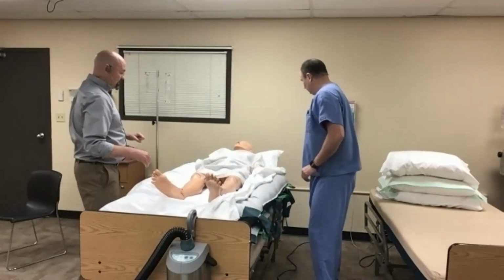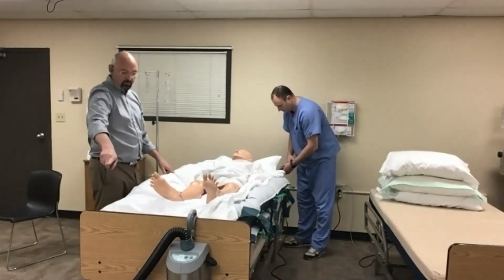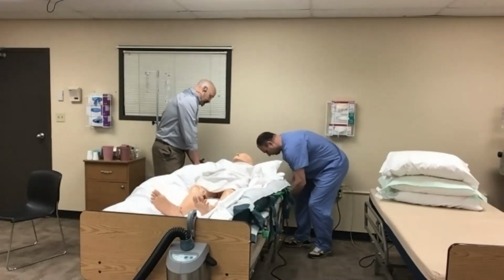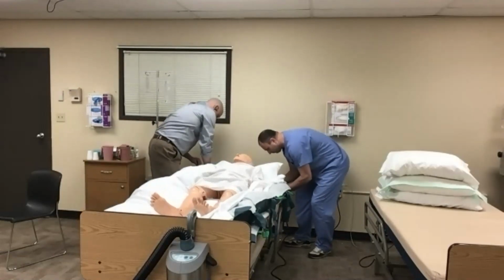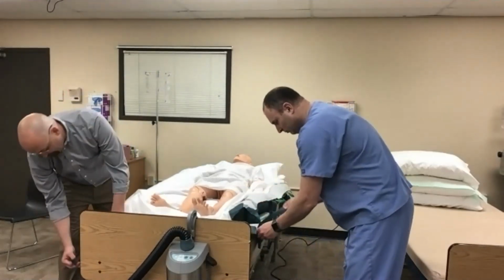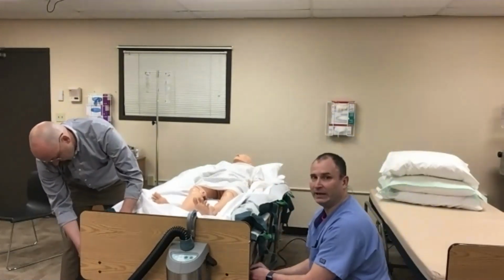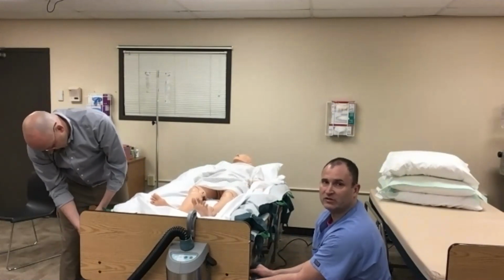So what we did is 2 people held that top mat, and 2 people slid the new mat in place. We're then going to connect that mat directly to the frame of the bed, both at the head and the feet, and that's going to lock that mat in place when we go to remove the top mat and then to prone the patient. Now, if you do not have a link, then you would obviously want somebody to hold that so it doesn't slide.